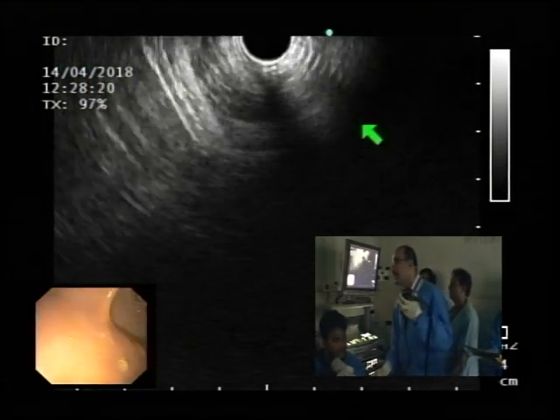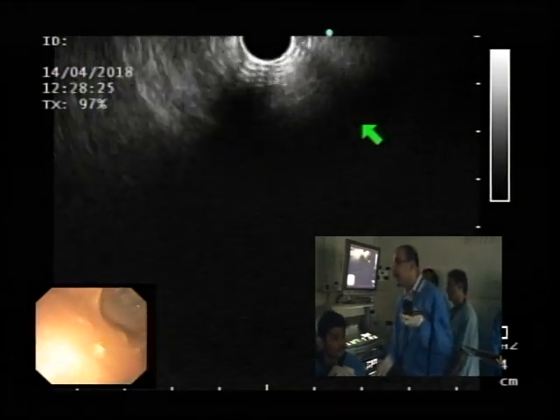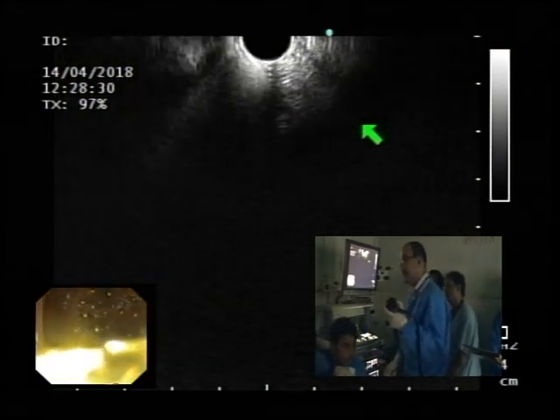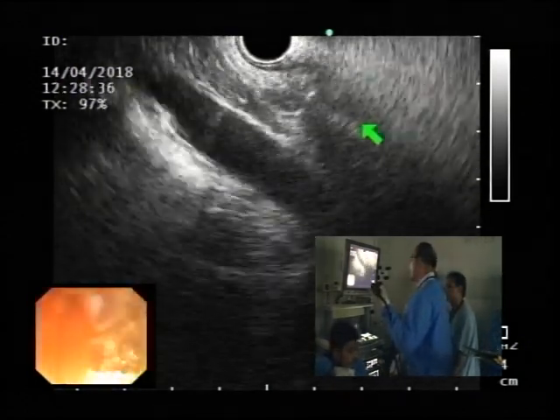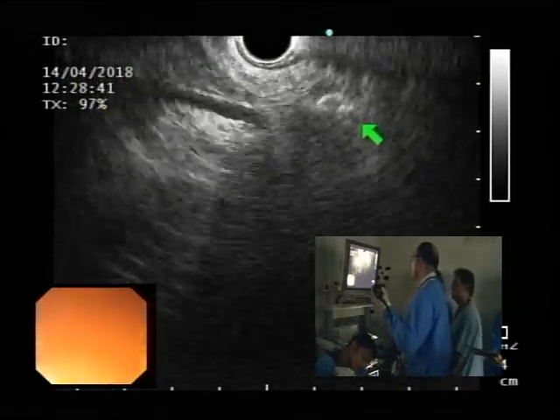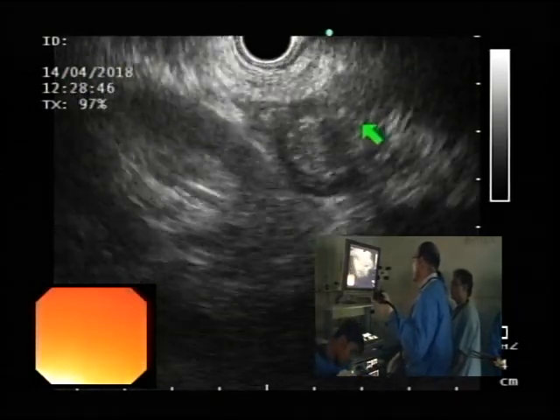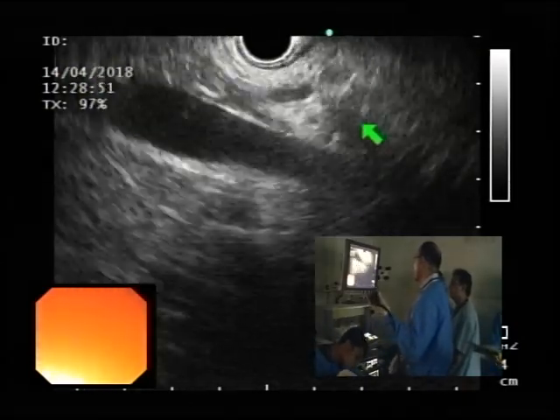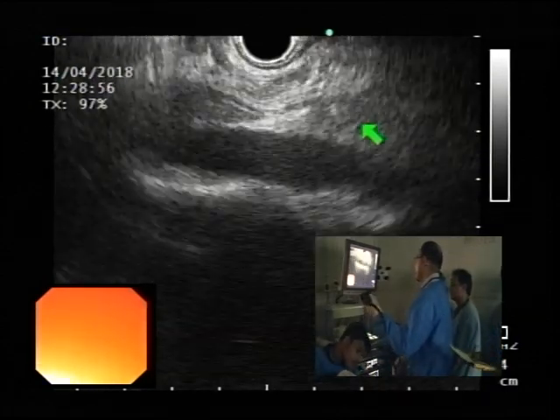The other view to look at is now, if you look at the endoscopic view, I was more proximal. If I go in and suction just before the pylorus, and now I turn clockwise, and now if I start pulling back, I will soon come upon the splenoportal confluence from the other side. Kai dafa ye hota hai ki isme your scope slips and you go back into the proximal stomach. But let me just see if we can do it this way here.